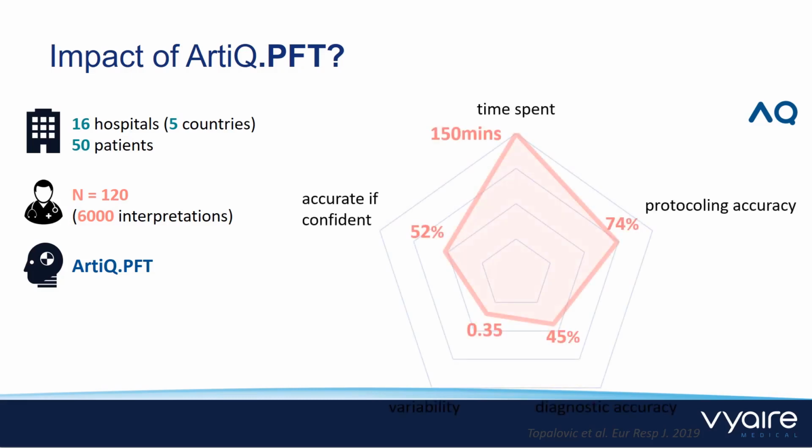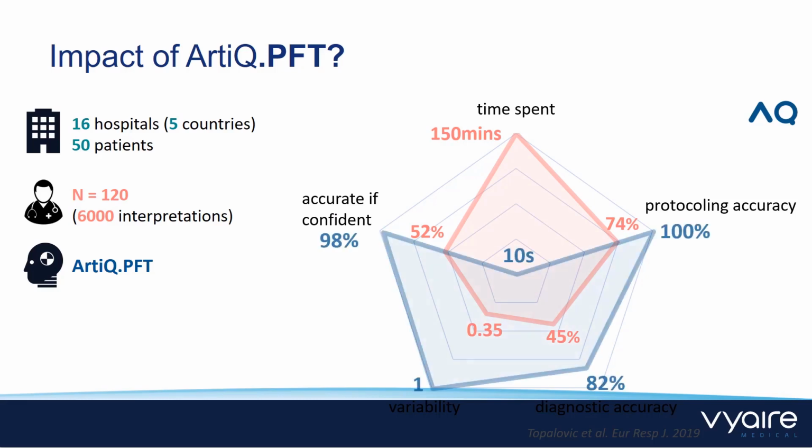The most remarkable results are related to the capability of the software to predict the final diagnosis. The software has an 82% accuracy, almost double the result of the average individual pulmonologist in the study. When the calculated probability is high, this accuracy even goes up to 98%.